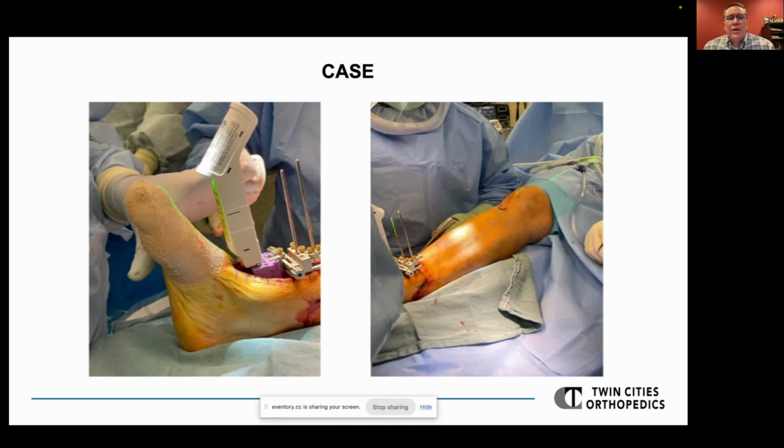There's the option of a laser that we can then attach to that tibial alignment guide. We can turn it down towards the toes. If you're a believer in referencing rotation off of the metatarsals in the foot, you can line that laser up with the second or third metatarsals if you like that as a way to assess rotation. Turn the laser around and send it up her knee and try to assess varus valgus alignment, to make sure the laser is lining up with her tibial tubercle so we're positioned in appropriate varus valgus alignment using that fast track device.